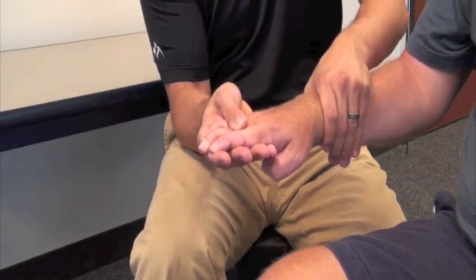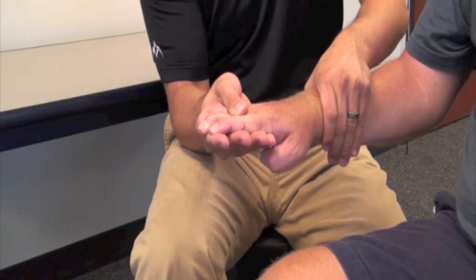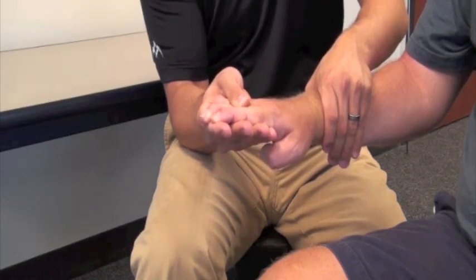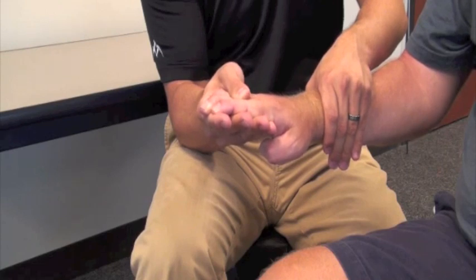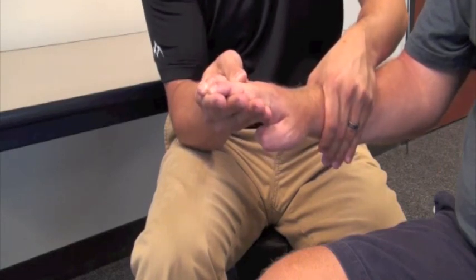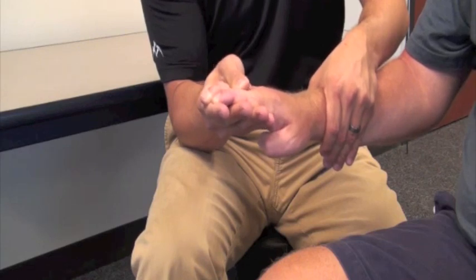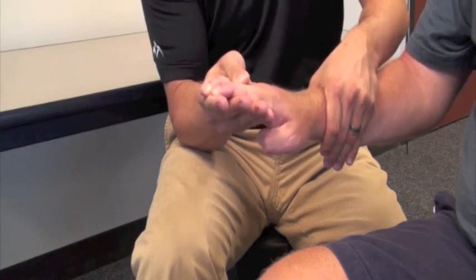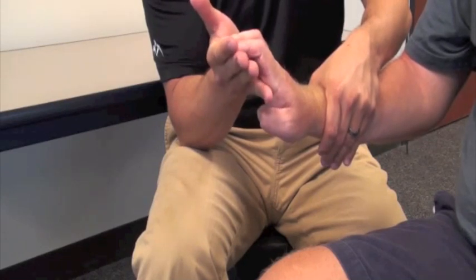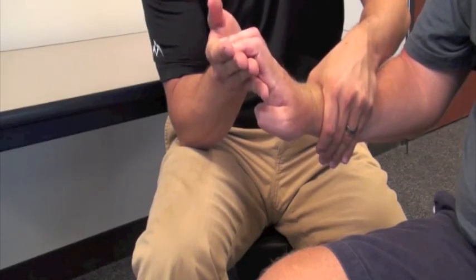You can also notice some blanching that's going to occur, but you've got to make sure that the digits are in a straight position. I'm starting to feel some resistance right at about plus five degrees, a little above neutral. So we're going to set the wrist angle on the Sabo Stretch to about plus five degrees. If we bend the wrist mount to plus 35 degrees, you're going to start to see the fingers draw back — so that's not the appropriate wrist angle position.